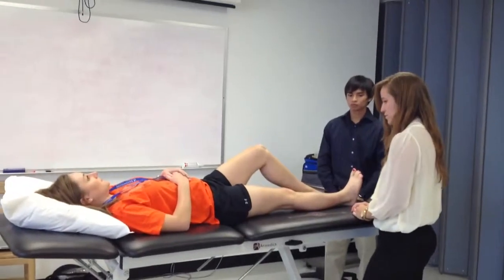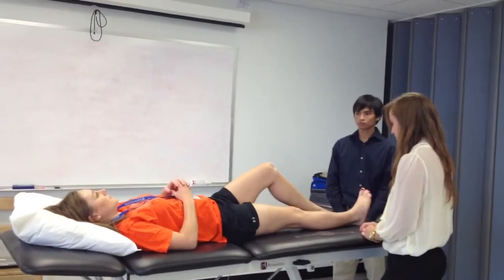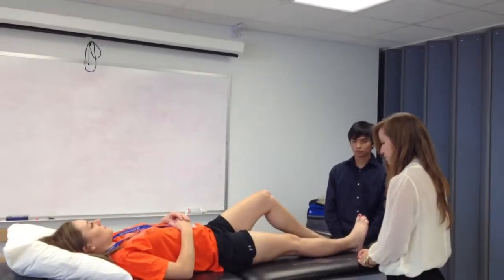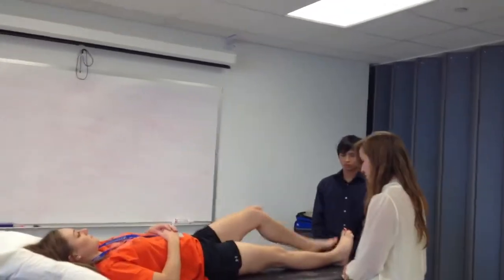Today we will be measuring knee flexion. Knee flexion occurs in the sagittal plane. First, make sure the subject is supine with the knee in extension and make sure to position the hip in neutral.